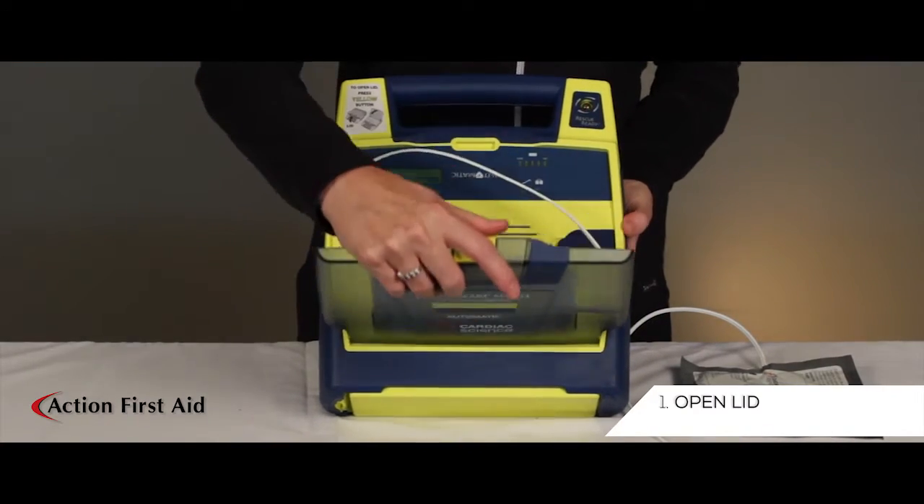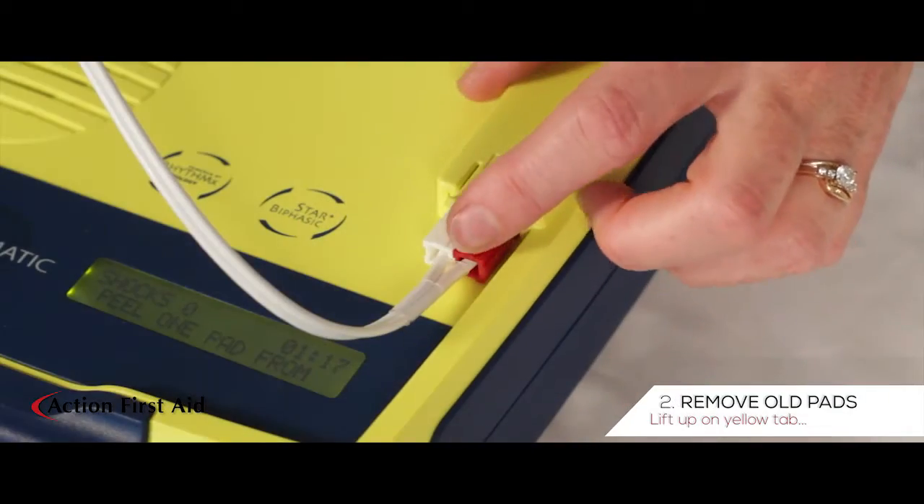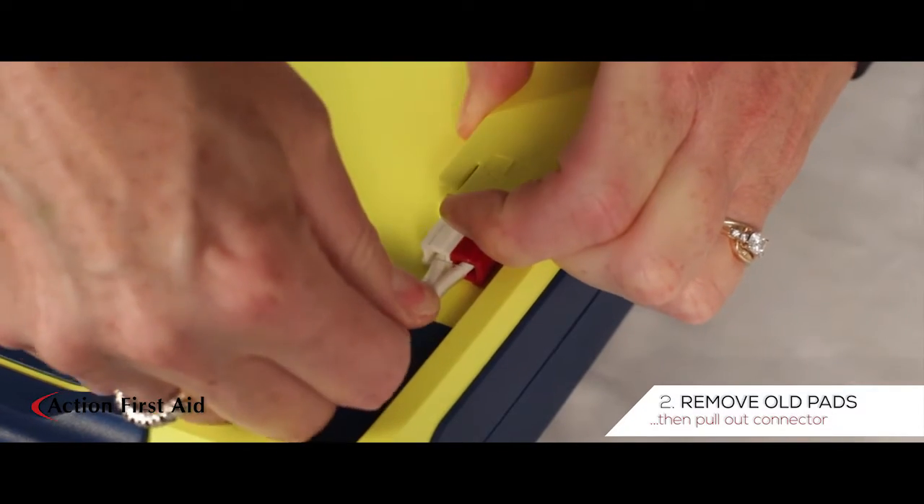Open the lid. Remove the old pads by lifting up on the yellow tab before pulling out the connector.